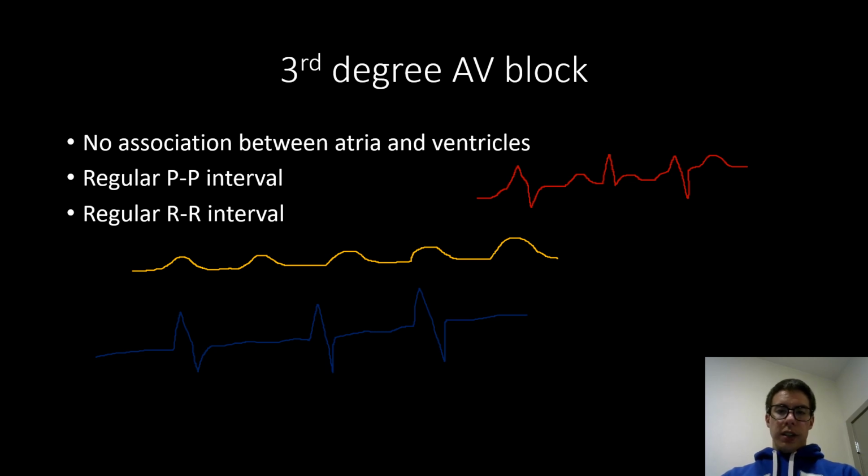The reason for that is that on that first QRS, since there is this P wave, they're basically just going to be on top of each other. So if we put these together, that's where they would fall, those waves. So this upslope to the P wave is a little bit before the beginning of the QRS. So that's this right here, that little notch, that would be a P wave. And then it's still kind of there at the end, which is like that right there. Now we have an unobstructed P wave, so we can see it. But then in the second QRS here, there's this P wave starting around in this area. So that causes it to do that right there. And then we have another P wave going into the last QRS, and then this final P wave is after. So here's what I'll do.